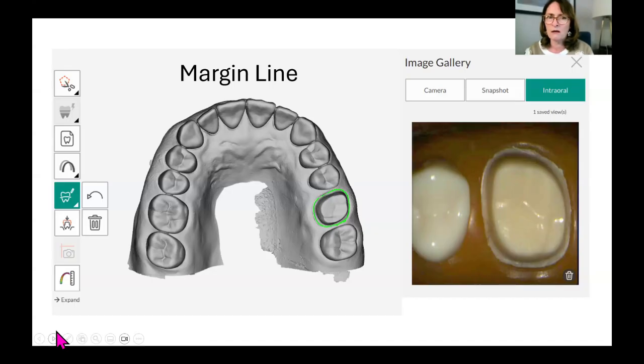What we see a lot is that it looks marked from the occlusal, and then in the design software, when you move it to the lingual or the buccal, it's completely off, like completely off. And so the doctor wants you to use the marked margin, but it's off. So then we go back and forth in communicating about that.